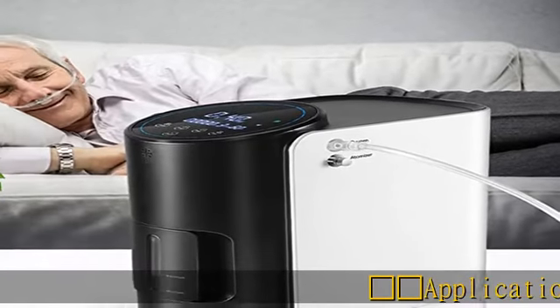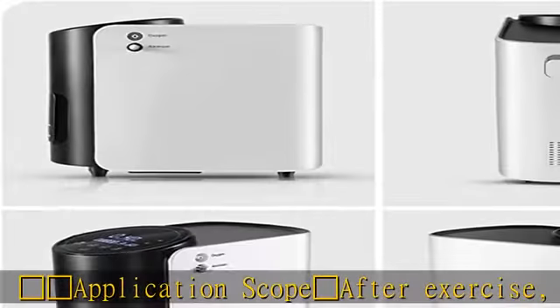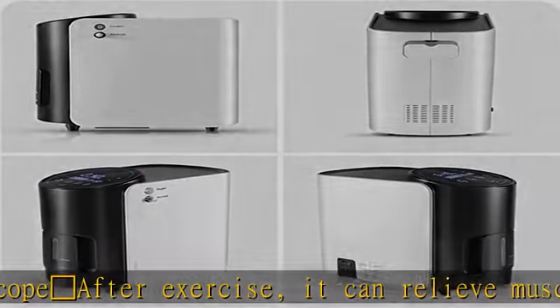Application scope: After exercise, it can relieve muscle soreness. When you're tired, it can relieve fatigue and improve work efficiency.